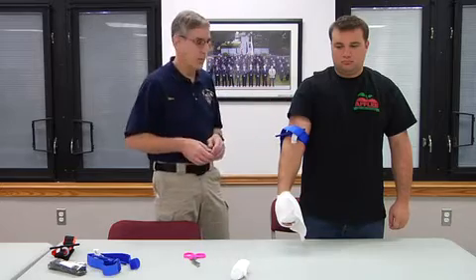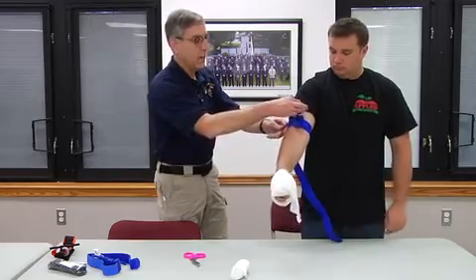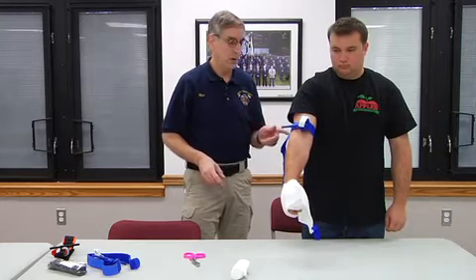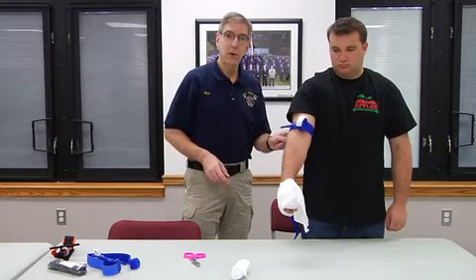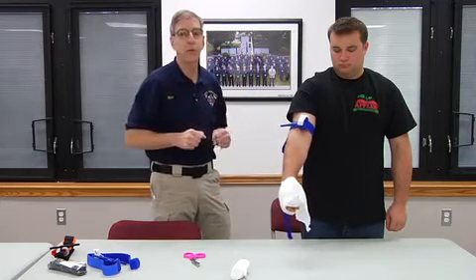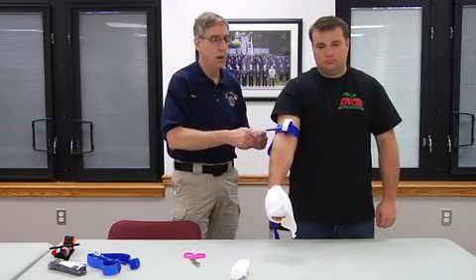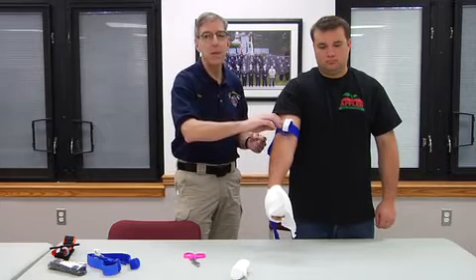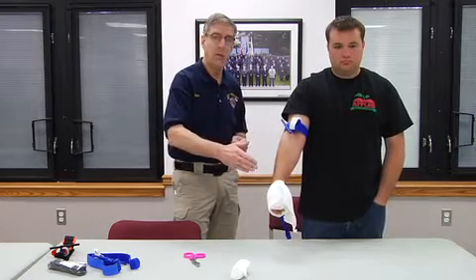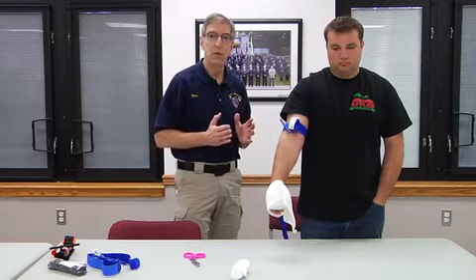A couple things I want to talk about with tourniquets. We can loosen this so that it's not cutting off your circulation. But the initial application of the tourniquet is where most tourniquet failures occur. You saw he took the band when he was applying the tourniquet and pulled it really tightly on his arm. That's where most tourniquet applications fail, not putting enough initial pressure on the tourniquet. You really should only need 1, maybe 2 turns of the windlass in order to get the tourniquet to adequately cut off blood flow. And now that we're talking about that, it may not necessarily work with every application.